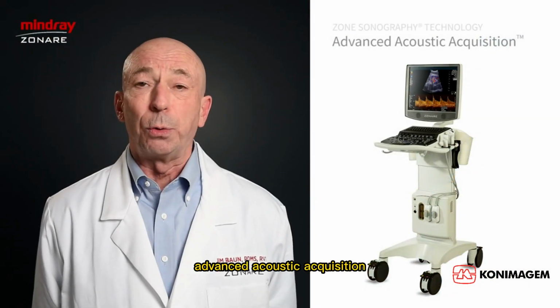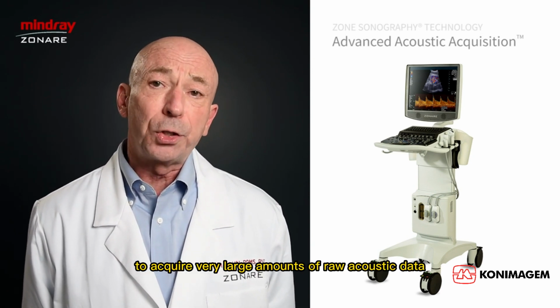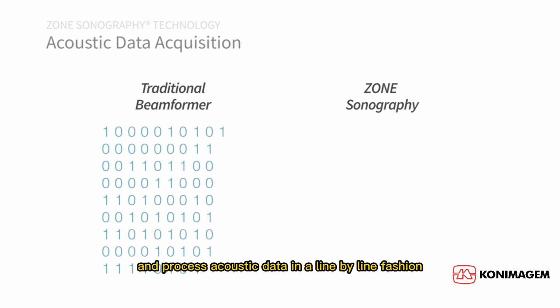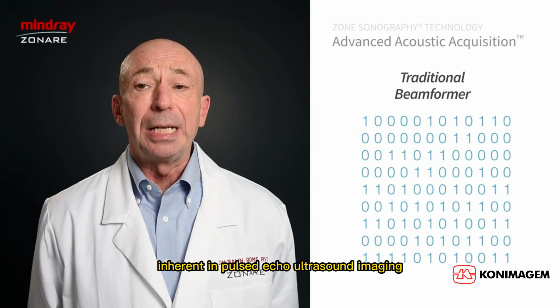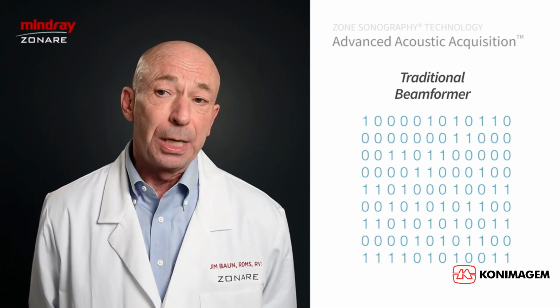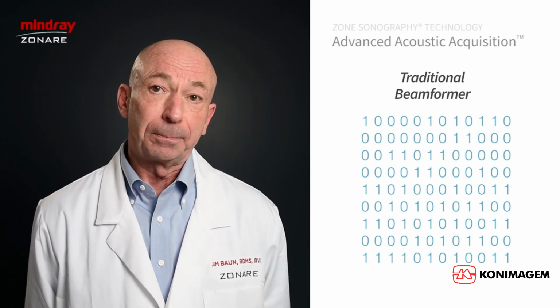Advanced acoustic acquisition refers to the ability of a ZST ultrasound system to acquire very large amounts of raw acoustic data in a very short period of time. As demonstrated in this animation, traditional beamforming systems acquire and process acoustic data in a line-by-line fashion. Because of the time of flight limitations inherent in pulsed echo ultrasound imaging, this method of data acquisition imposes well-established temporal constraints on image acquisition and on signal processing capabilities.